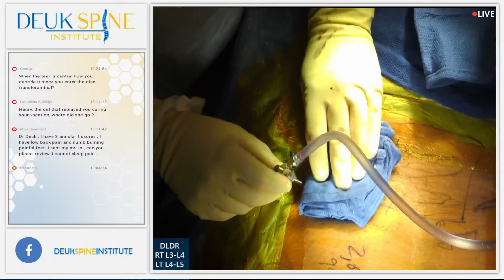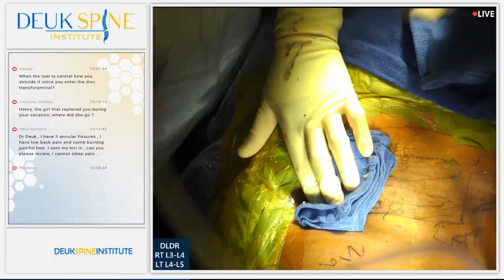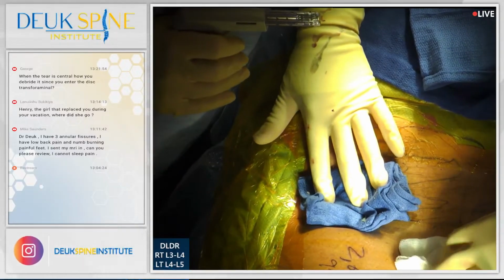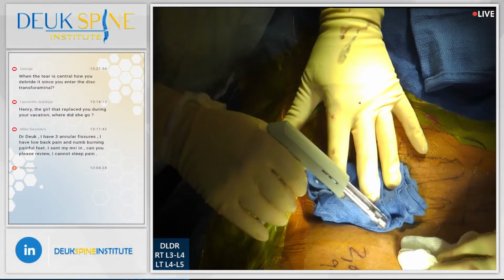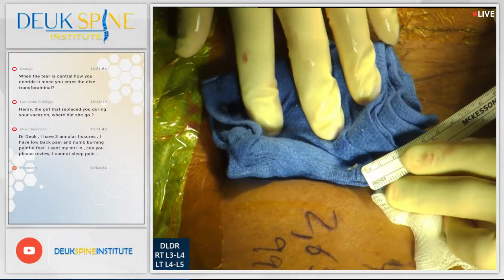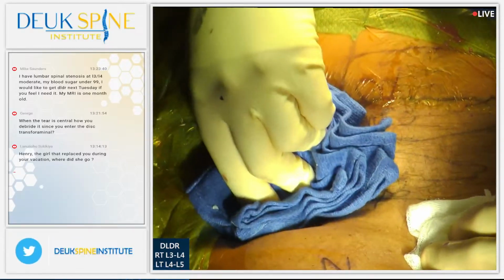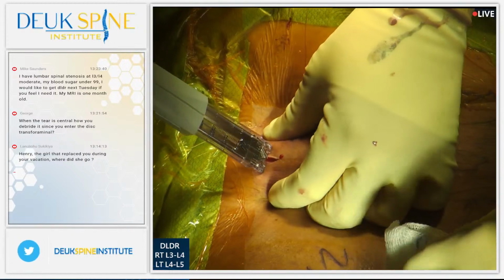All right, I'm going to take this tube out, and what we're left with is basically a tiny little cut that's a quarter inch. I'm going to put a staple in that cut, and there's a piece of herniation right there, by the way. Can you guys see that? A little piece there. There's another piece there. They're kind of all over the place. And that's fine as long as they're not in the disc. I'm happy because when they're in the disc, that's where they're causing pain. There's the cut right there, folks, a quarter inch.